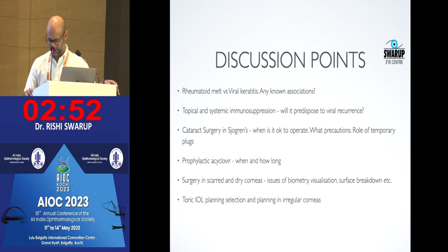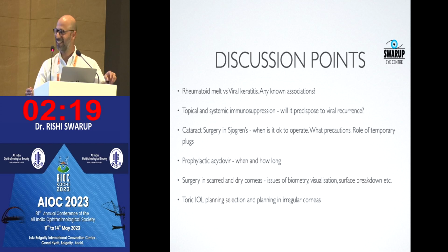I think you did a good job there. I think counseling to the patient is extremely important. Their expectations, so they can't expect something how a regular eye would behave. So basically, our goal is to debulk the amount of astigmatism. You may not hit a bang-on reduction of every astigmatism. Suppose the patient has 5 astigmatism, if you're reducing by 3, still the patient would be happy. Only thing, patient should not expect a 6/6 as unaided. You should be able to take the confidence of the patient. I think that is the key thing in all premium lenses: expectation management. Yeah, that is true. More so in these patients where it is debatable.